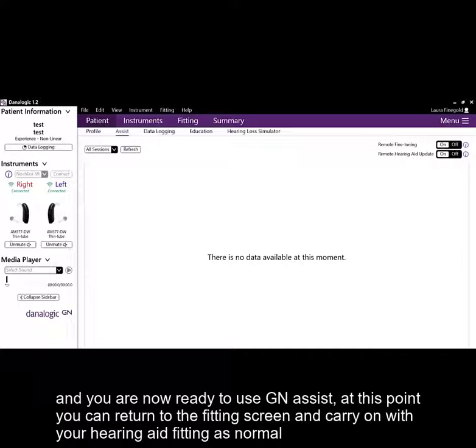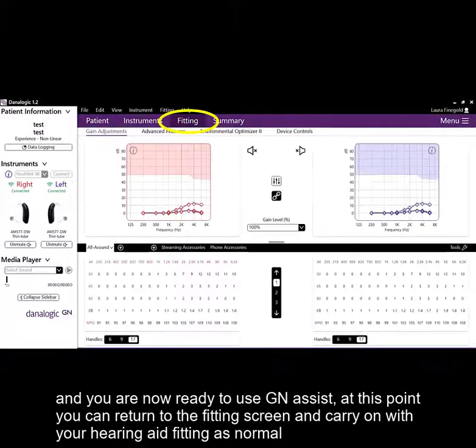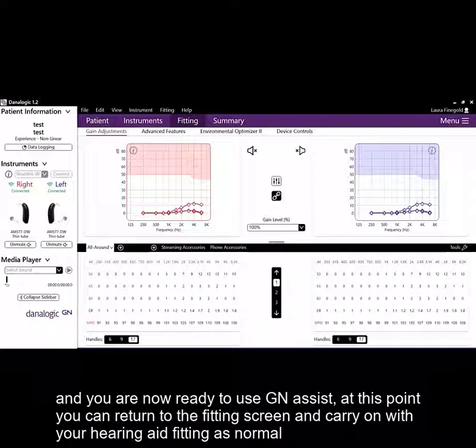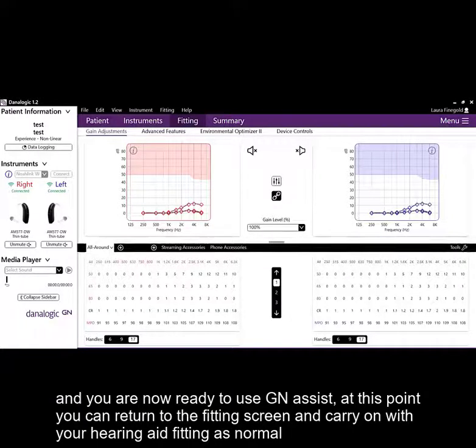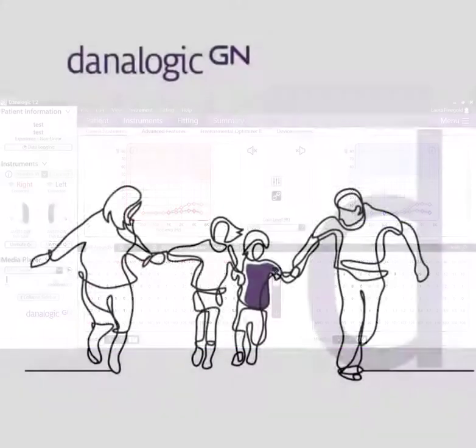And you are now ready to use GN Assist. At this point, you can return to the fitting screen and carry on with your hearing aid fitting as normal.